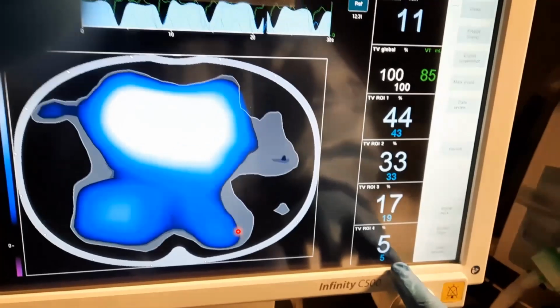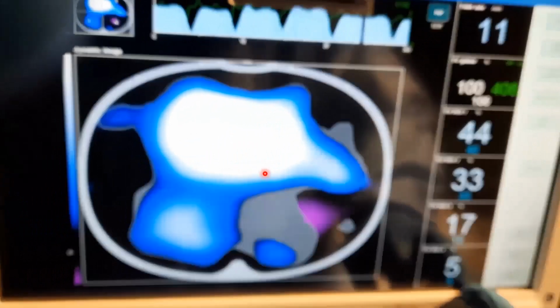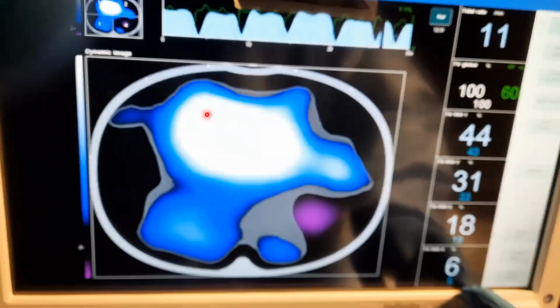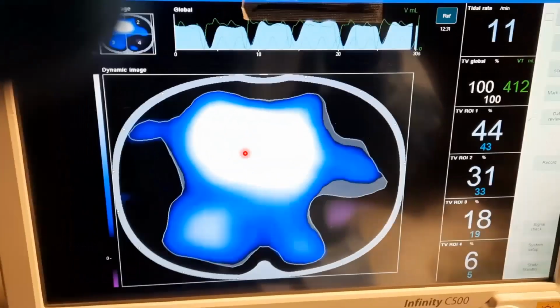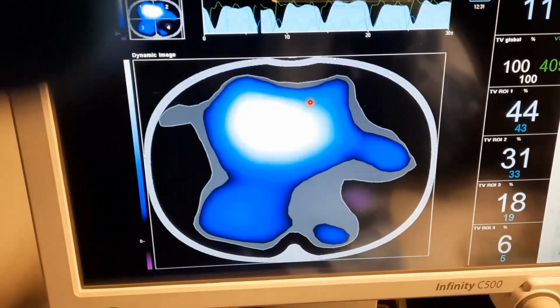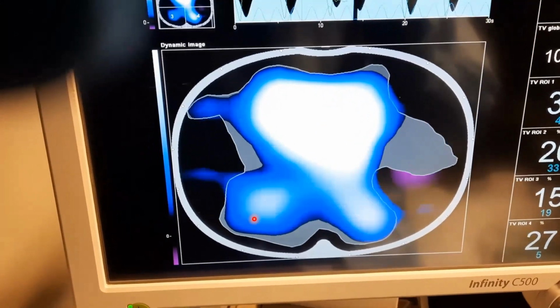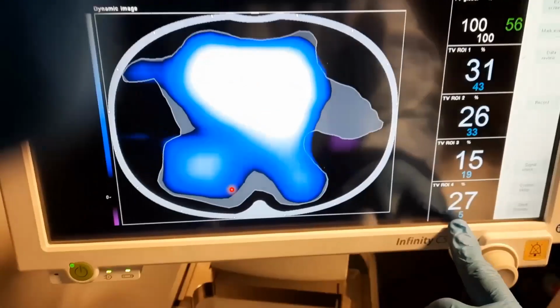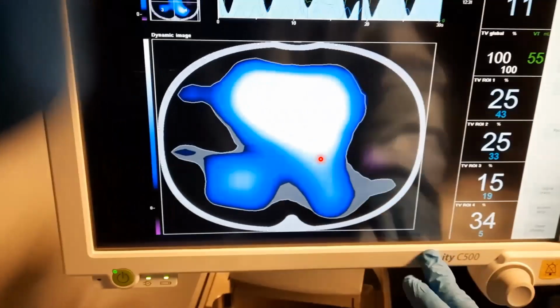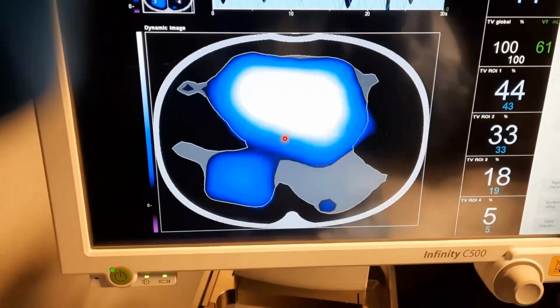Another thing we could do is actually prone the patient. By proning the patient, we're going to put more weight on the ventral areas because the patient's going to be lying on their stomachs. And we could be, in a way, splinting this area here. And that dorsal region that no longer has the weight of the patient could open. And you'll see in the coming videos, we've done this a couple of times pretty successfully, where we see the possibility with APRV of opening up here, but we have that white area. So proning, we've had some good results if we actually see this pattern and end up proning.